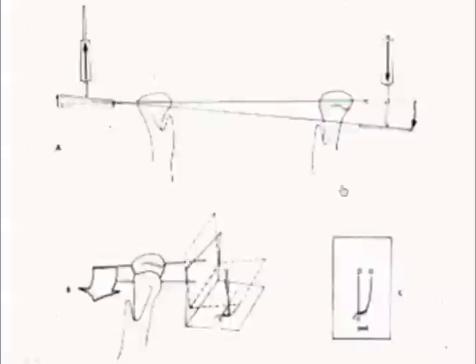Well, as you move your jaw laterally, the condyle is actually moving down, which is moving the plate down away from the stylus. And you can see that the distance from the edge of the plate to the stylus here is longer than it is here. So as this plate moves down, the stylus stays in the same orientation, and it creates this sweeping motion across the plate, inducing an artifact of immediate side shift on the recording plate.